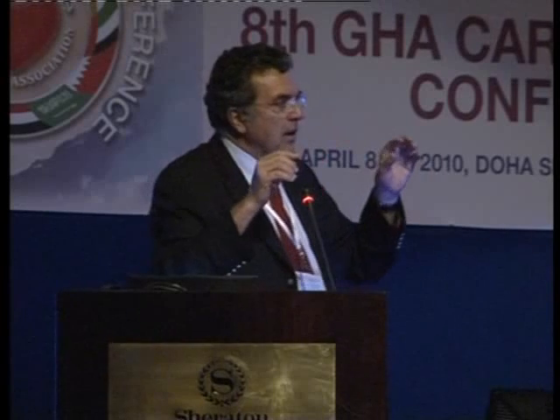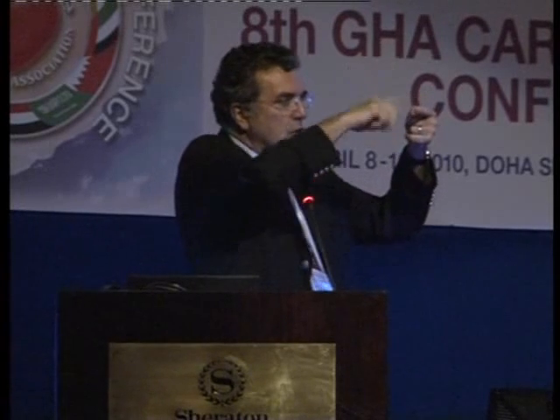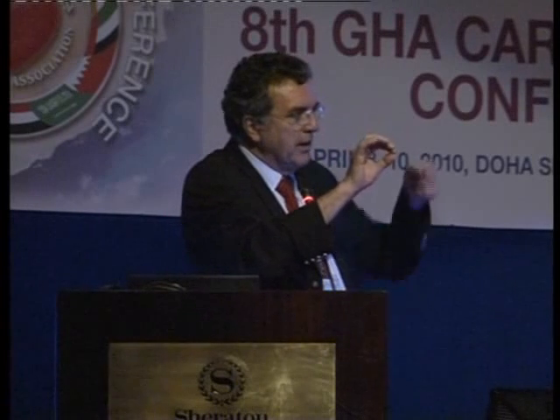What is important, what we see at the beginning, is that you have to equalize the pressure, of course, in order to avoid a bias in the calculation of the FFR. This is the first point. Be sure that before starting we have the two systolic pressures totally similar. Then we have to cross the lesion. Be sure that the point of your distal pressure hole is distal to the lesion, of course.